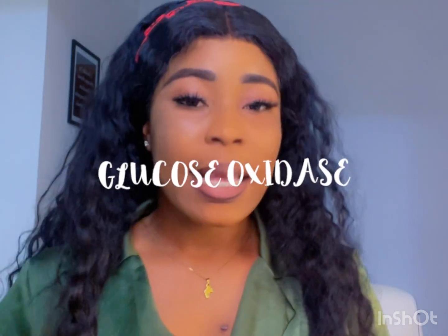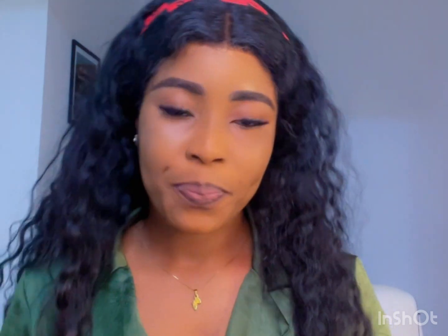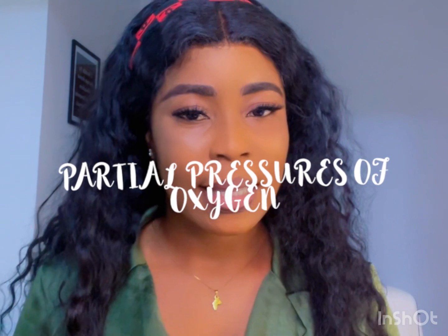Again, there are two main enzymes that are used in producing these blood glucose monitoring systems. One is the glucose oxidase enzyme, and two is the glucose dehydrogenase enzyme. Now, the glucose oxidase enzyme has interferences with oxygen. And on the other hand, the glucose dehydrogenase enzyme has no interferences with oxygen. So this is when the partial pressure of oxygen sets in.